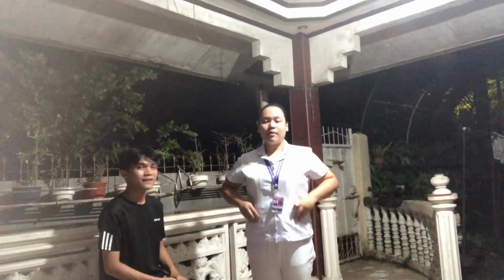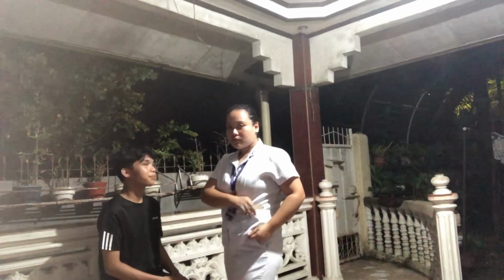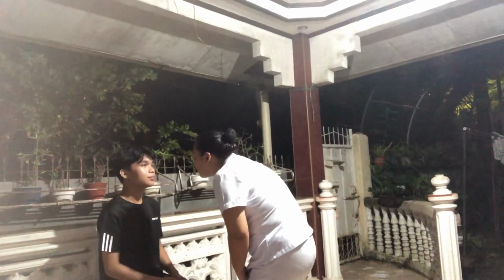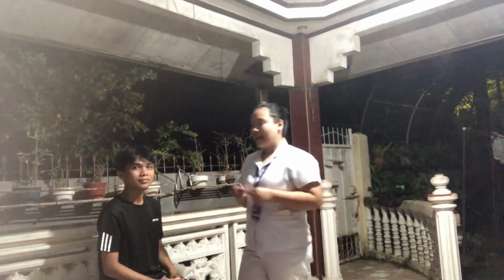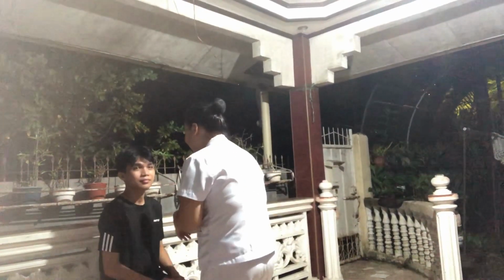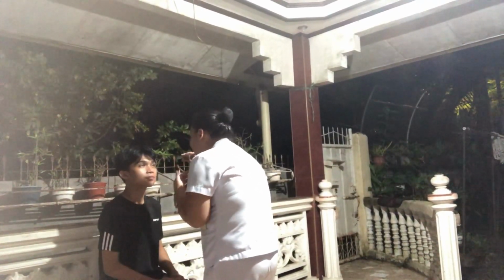Now look straight into my eyes, sir. Okay, thank you. Now I'm going to inspect each cornea and lens for clarity and texture. So I'm going to use my penlight to check the cornea and lenses. So, sir, please look into the light.